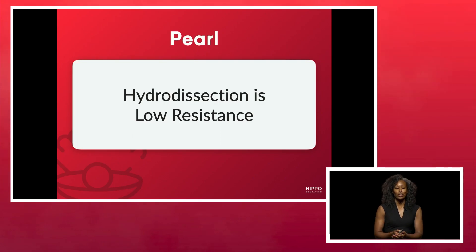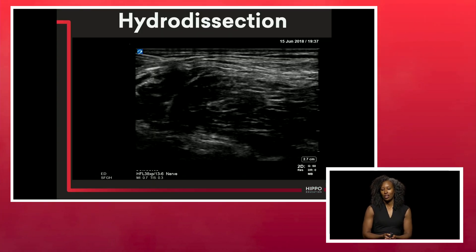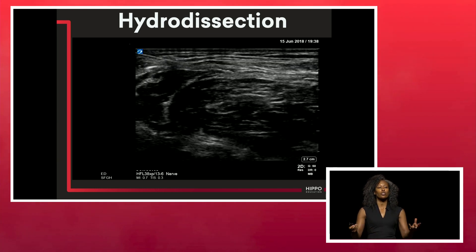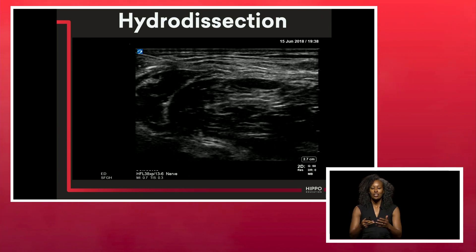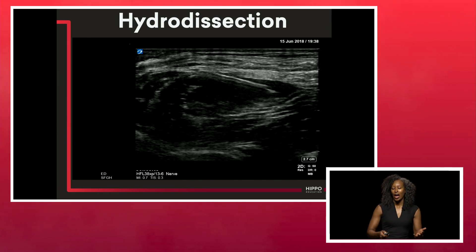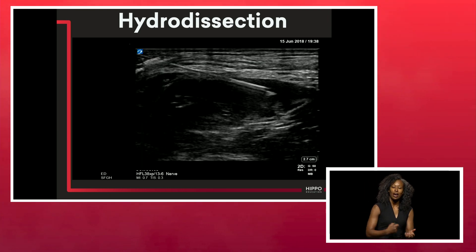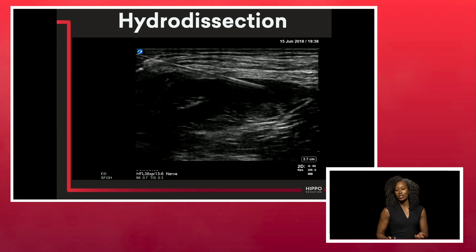Hydrodissection should be low resistance. This is a fascia iliaca block going in through the fascia — you'll see this beautiful, smooth spread of anesthetic. You can advance your needle and continue to hydro-dissect. If you were to go into the muscle, you'd get a lot of resistance, letting you know you're not in the right space.